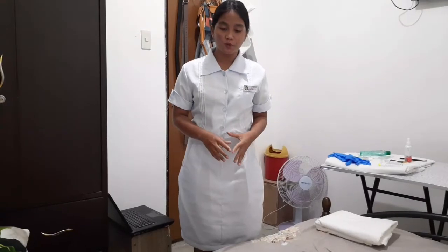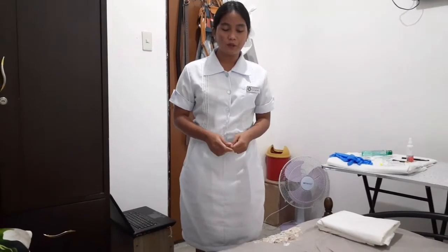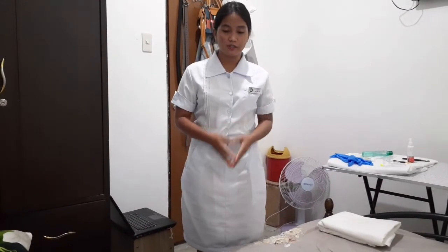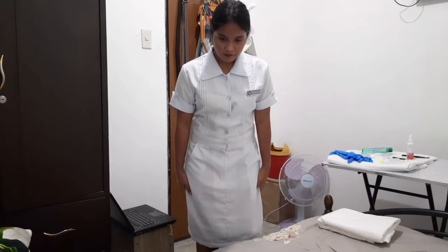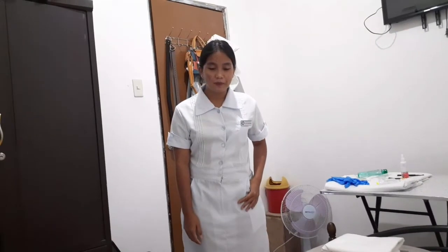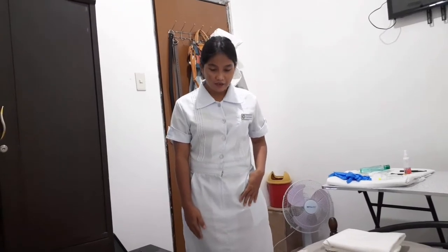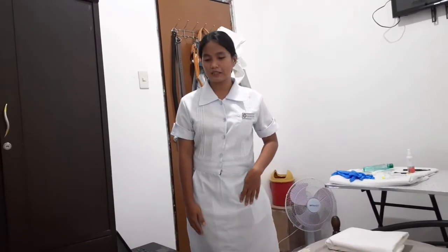Make sure that the patient does not have her monthly period, and be sure that the client has not had sexual intercourse for 3 days. For today, we're going to conduct a pap smear test. We're going to look at your cervix for signs of infection. So, is it okay with you? Yes, ma'am. Okay, thank you. Ms. Santos, just to make sure, you don't have your monthly period today, right? Thank you, Ms. Santos.